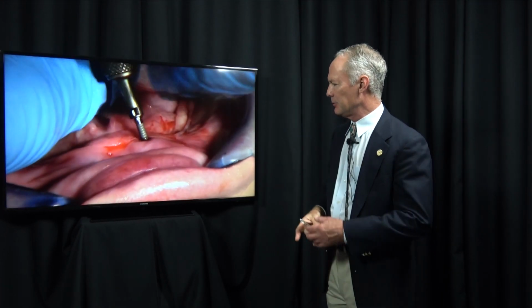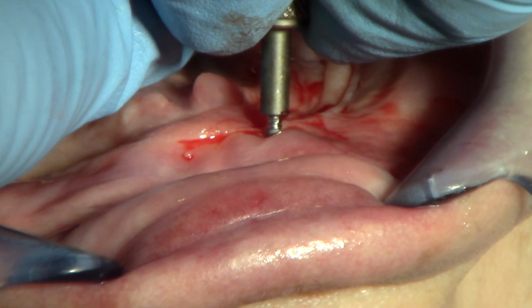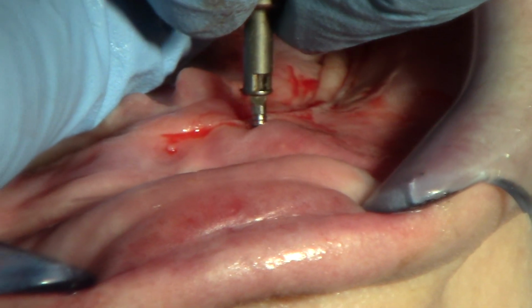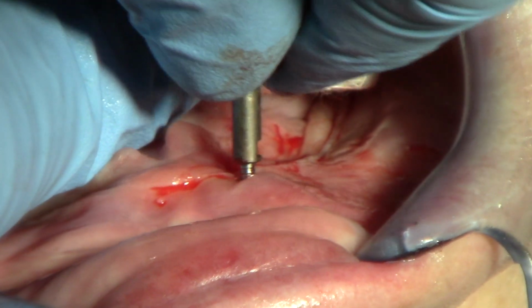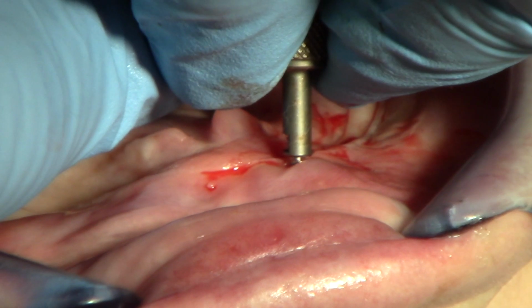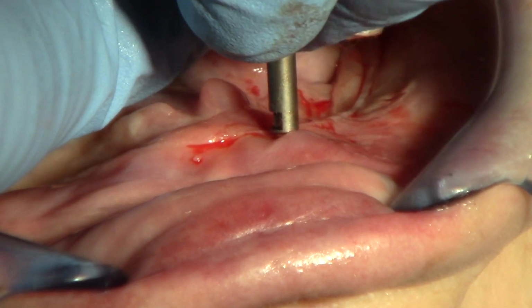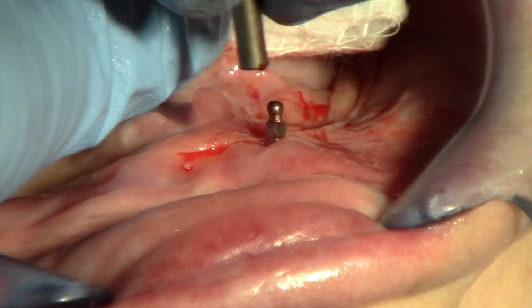Now there is an exception to that rule if we're doing a surgical procedure and extracting the teeth, and I'll show you that on a forthcoming video. You can use a larger implant in the mandible. So here's the finger driver. Now you should not be able to screw the implant all the way in with the finger driver.